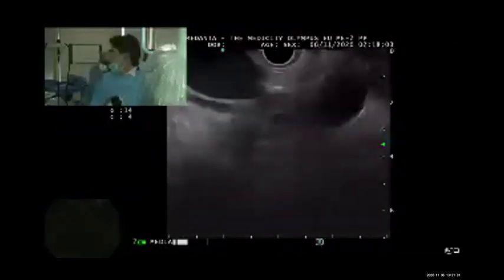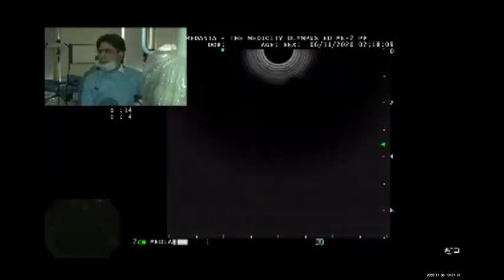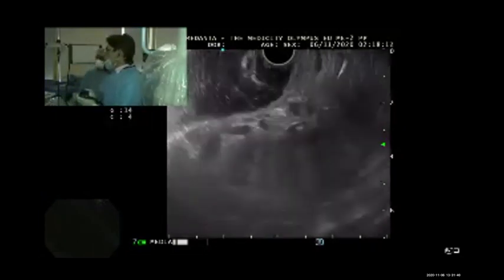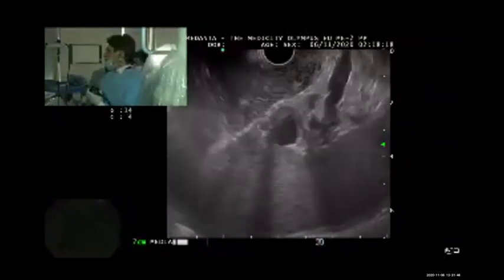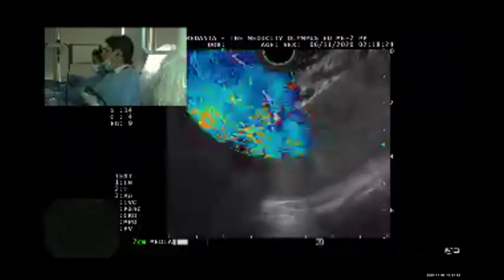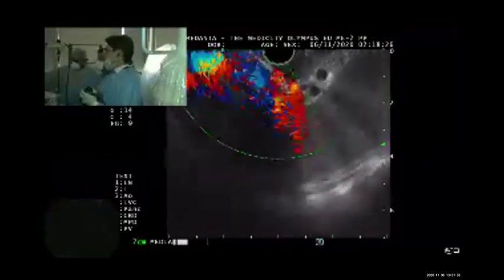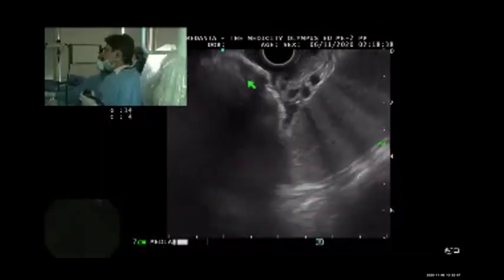Can you make it small? So I'm in the esophagus. I will rotate. Now you look here. Now the varix is coming into view. Now can you apply the Doppler, please? Can you see now? The complete varix is obliterated. Please remove the Doppler. Can you see the varix now? Can you see there's nothing in the varix? Yes. We just put the Doppler. You see there's no signal.